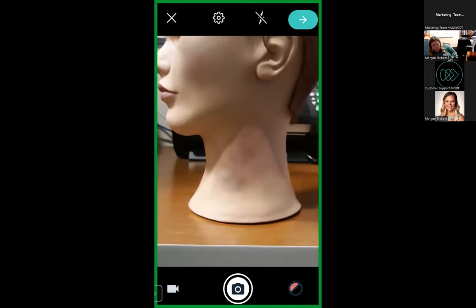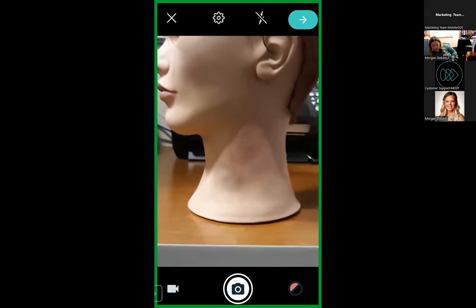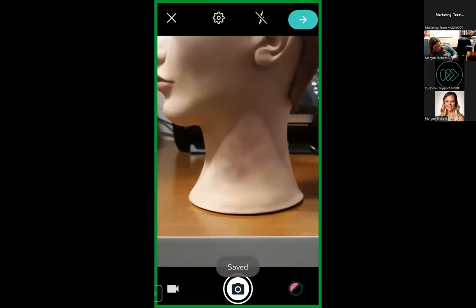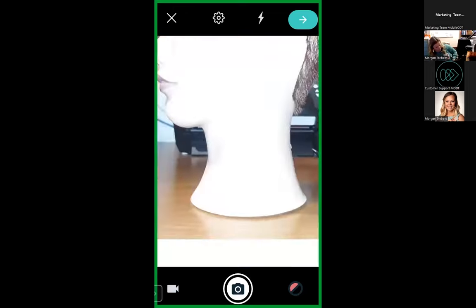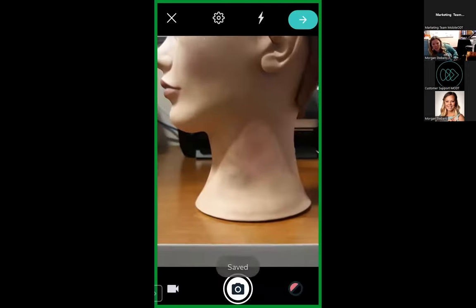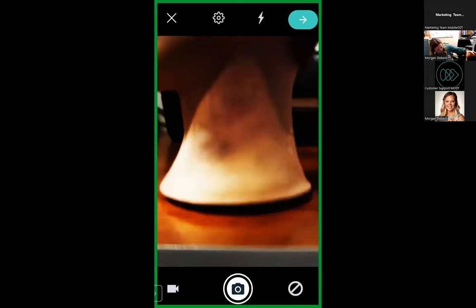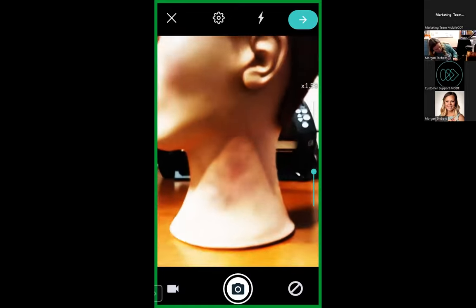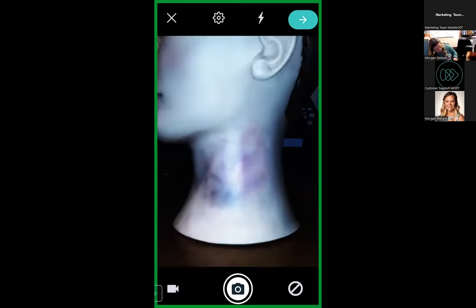So what I'm gonna do is take a picture right now as it's blurry with nothing on it, okay? So that's gonna upload. Now let's turn the flash on, and all I did was just touch that flash and take a photo of it with the flash on. So that is a little washed out. I didn't really like the way that looked. So let's turn the high contrast on and I'm gonna move it. And my flash is on with the high contrast. So let's do it with the flash on.